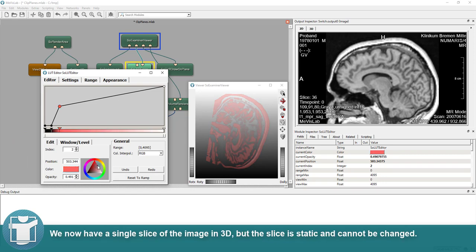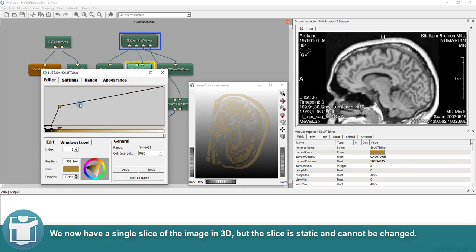We now have a single slice of the image in 3D, but the slice is static and cannot be changed.